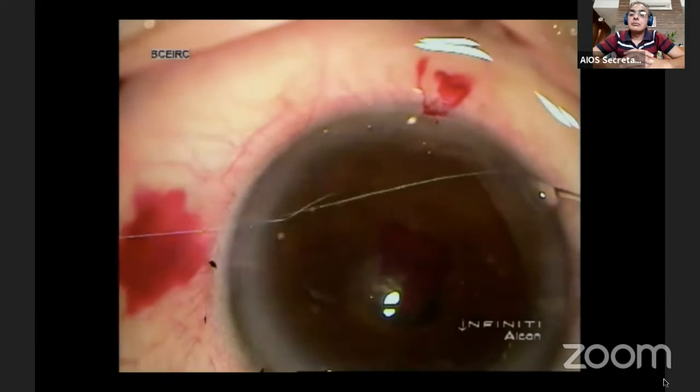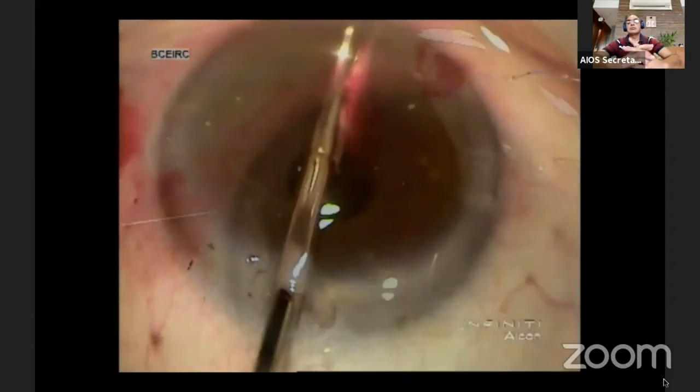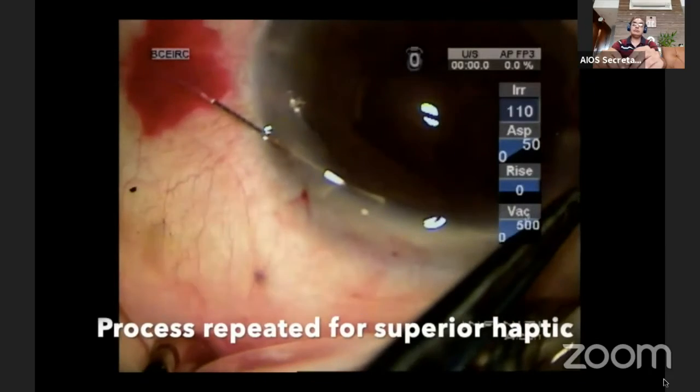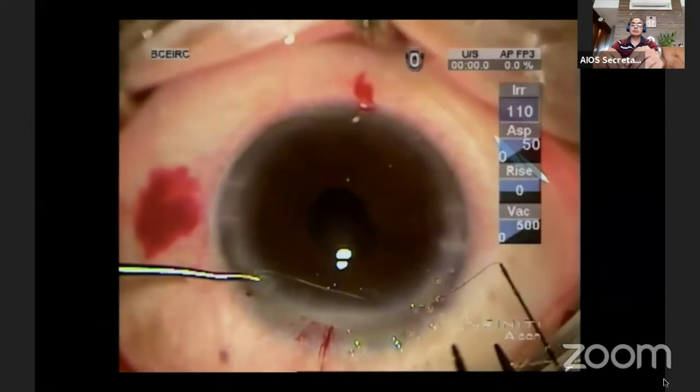The knot is secured by another throw in a similar manner. The suture ends are cut with micro scissors, and the process is repeated for the superior haptic.